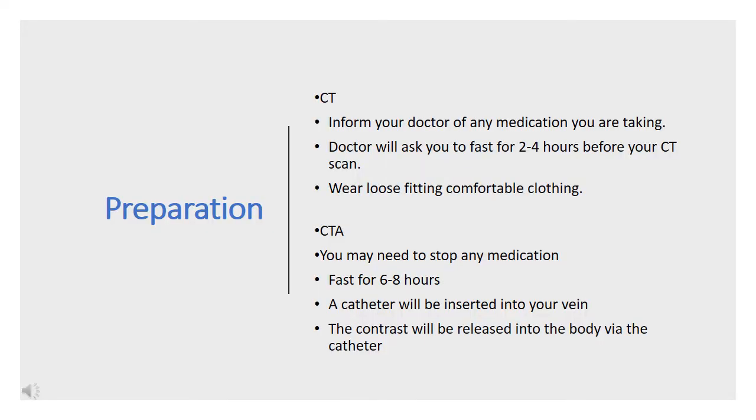The following is the preparation for CT and CTA procedures. Before your examination, you should inform the radiographer what medication you have been taking, as you may need to stop taking it before your procedure.